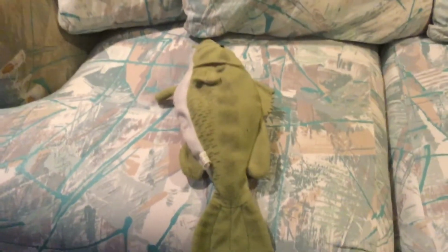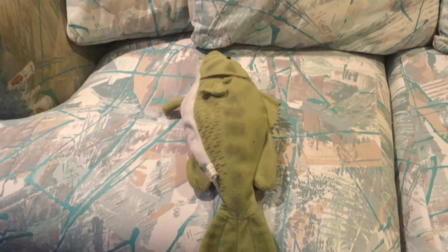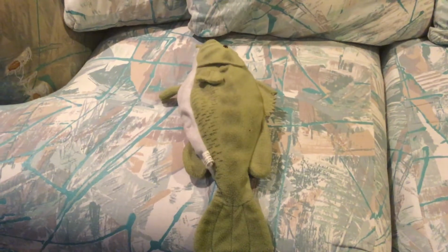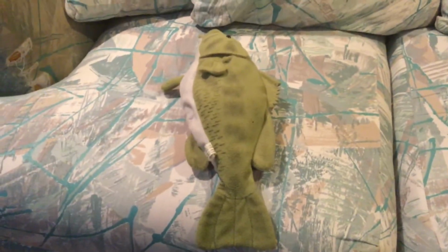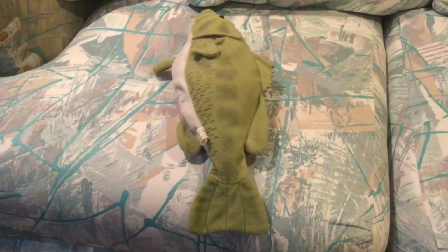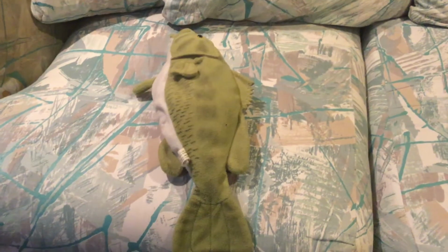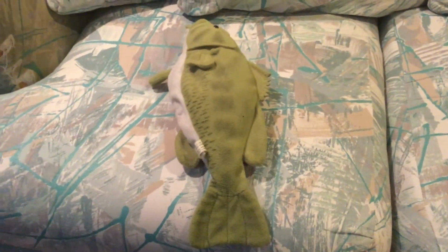Hello, so today I'm going to be demonstrating two nursing skills, and those are administration of oral medications and administration of medication via G-tube. So I'm going to begin by doing the administration of oral medications. I'm going to be reading through the skills as I practice on my patient Steve, the fish.